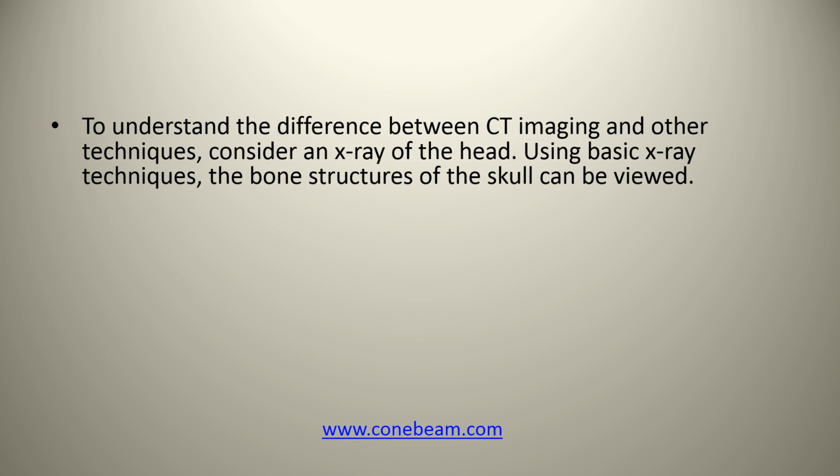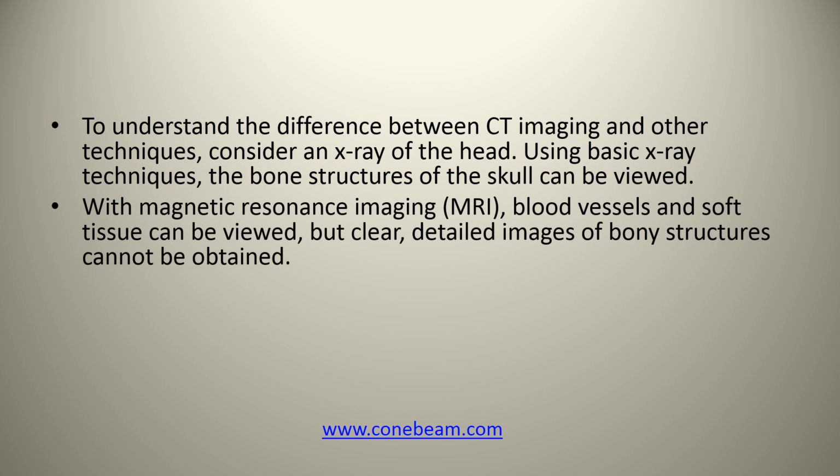So to understand the difference between CT imaging and other techniques, consider an X-ray of the head using basic X-ray techniques. The bone structures of the skull can be viewed. With MRI, blood vessels and soft tissues can be viewed, but clear, detailed images of bony structures cannot be obtained.